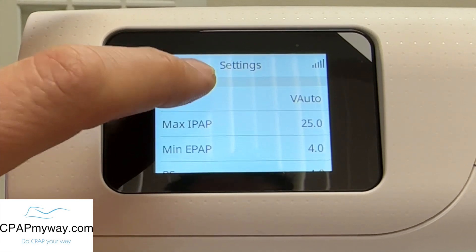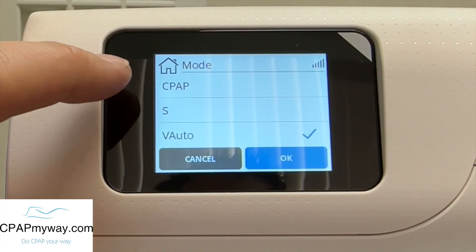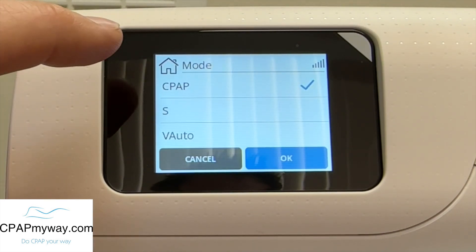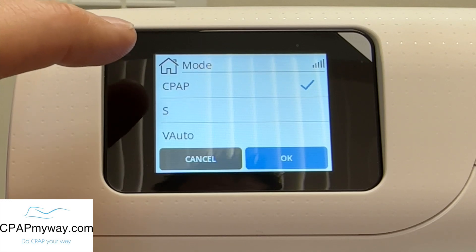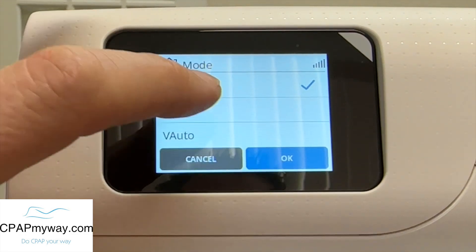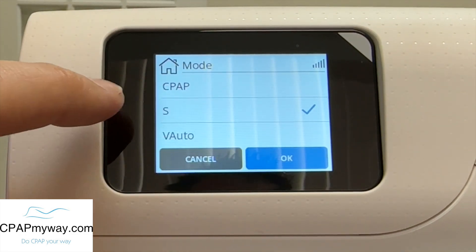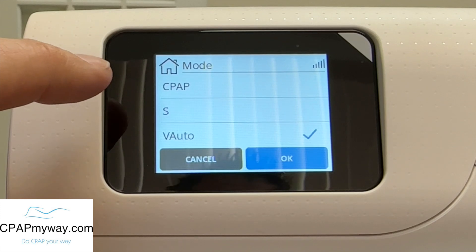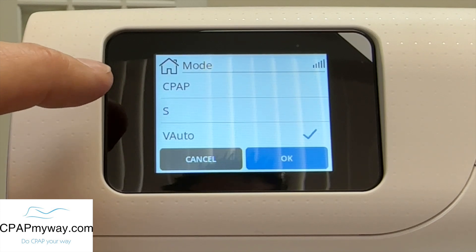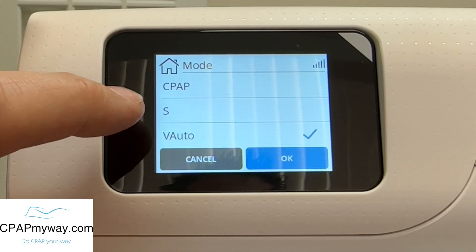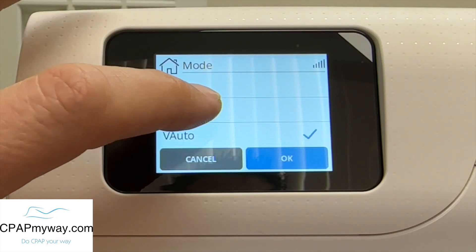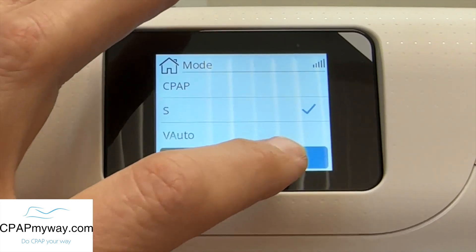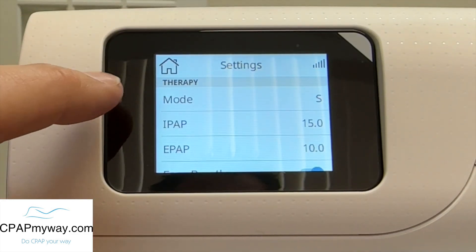Let's start off just with mode. It can be in CPAP mode, which would completely defeat the purpose of having a bi-level; S mode, which is a fixed pressure bi-level; or auto bi-level mode, which is labeled V-auto. For the sake of simplicity, we'll start off in S just to show you those settings.